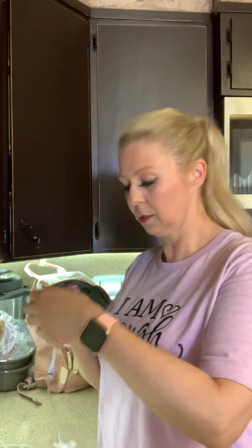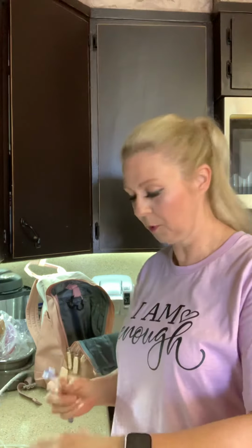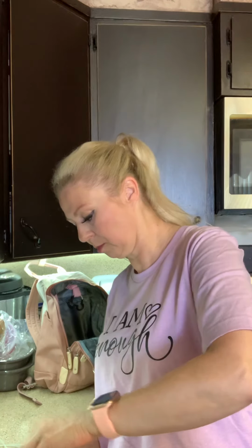These little things, they dig into your back, and this probably weighs about 3 pounds. Maybe it feels a little bit heavier because you got a battery in there, it has to charge. And when the battery is not charged, I'm attached to the wall trying to get my battery recharged so I can get up and move again. So sometimes I'm attached to the wall. So I'm going to attach this to the pump.